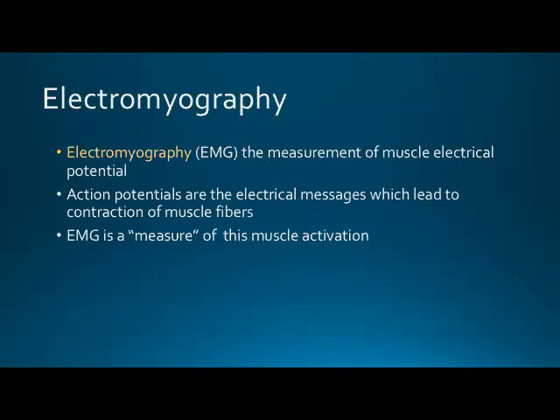Okay, so the main tools that we use to non-invasively, or in some cases actually invasively, measure muscle function. Two of the primary ones are electromyography and mechanomyography. We're going to talk about EMG first.